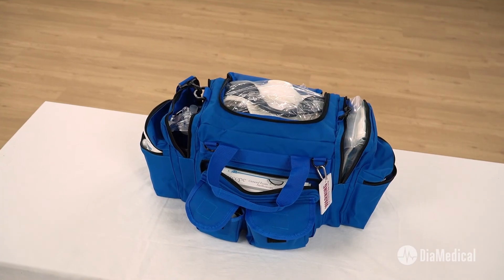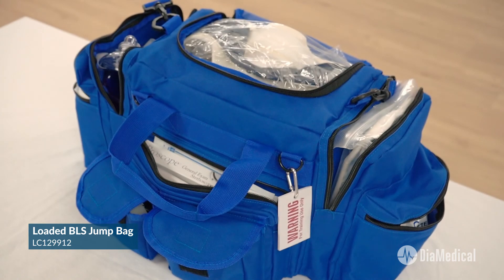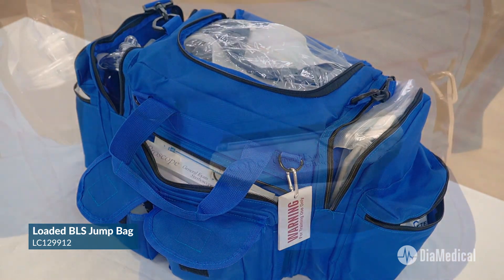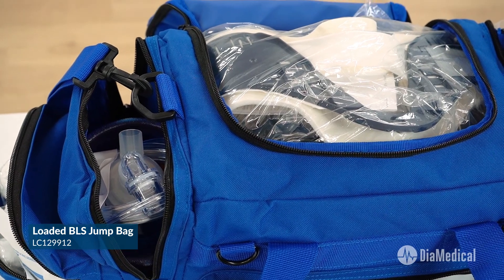The SimLab Solutions Loaded Training BLS Jump Bag is used to teach EMT students how to perform basic life support skills, including wound care, immobilization, and CPR with BVM ventilation.